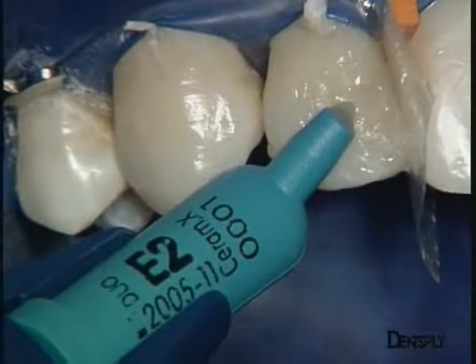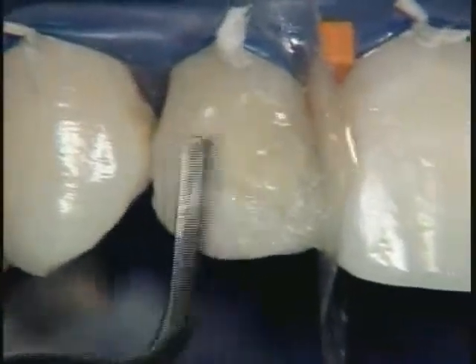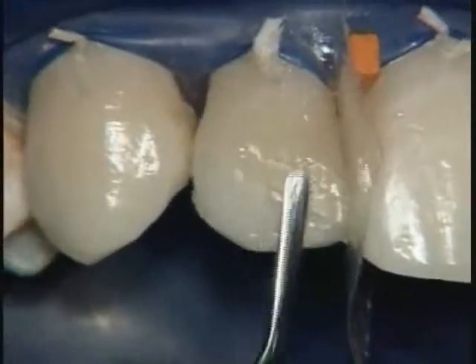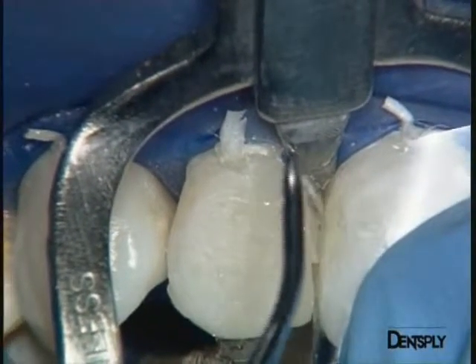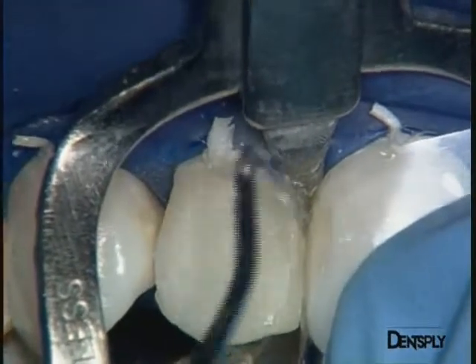We now come to the surface layers, where the E2 enamel replacement material can be used to make up the front face in a single operation. We work right up to the transition line with this material so that the surface material is more translucent, making this restoration a perfect imitation of the natural substance. This layer is polymerised. A little material is still missing along the mesial transition line — we add it using the Elberf separating device, which gives good separation between the teeth and a clear view of the area. This additional material is polymerised.